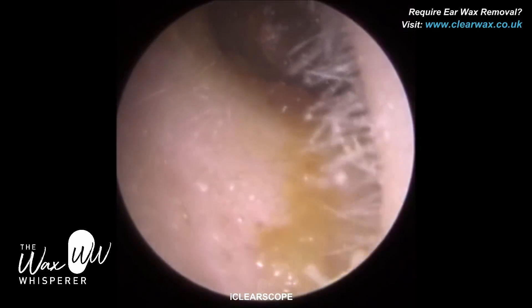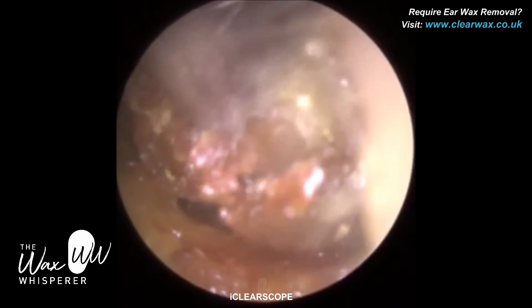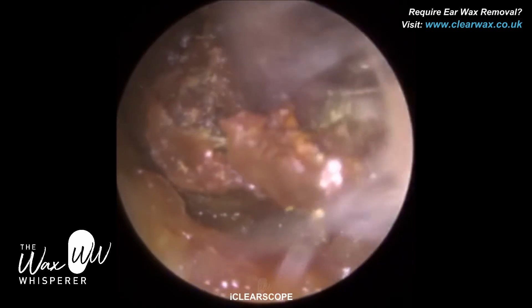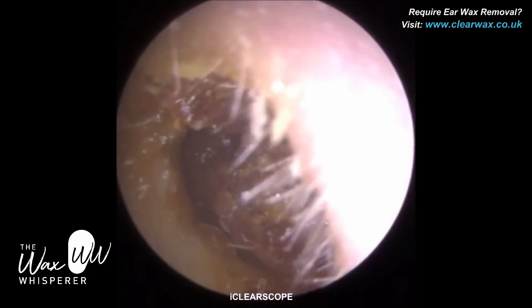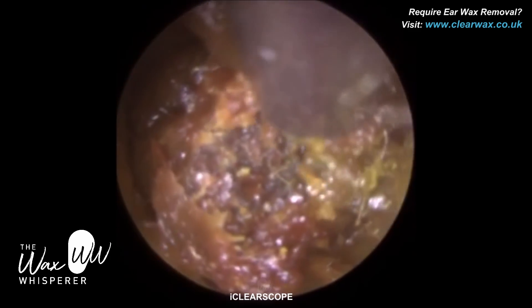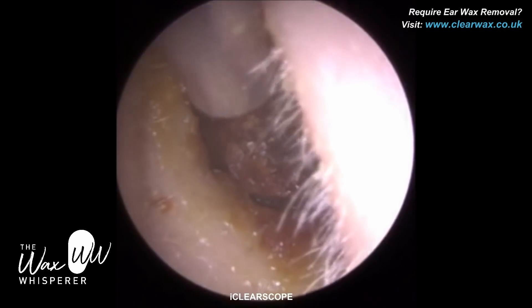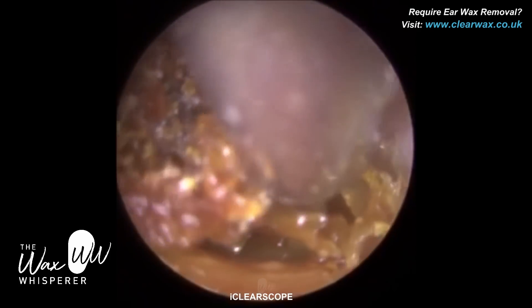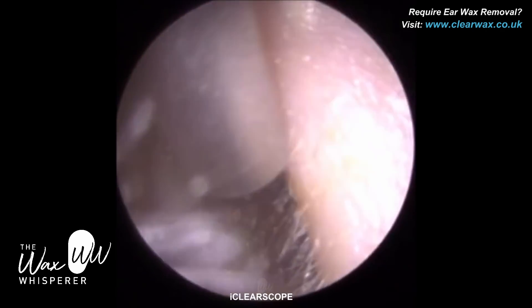With the iClearScope, our endoscope is autoclavable — so if you wanted to, you can put it in a steam chamber at 134 degrees centigrade and sterilise it using steam. The fact it's autoclavable also makes it waterproof, which enables us to use the chlorine dioxide solution. This solution is like a foam that you wipe all over the endoscope — it's an extremely high-level disinfectant and we've had it compatibility tested. Because our iClearScope is autoclavable, i.e. steam-proof and waterproof, we're able to use the solution, whereas the other endoscope, I don't believe, was.